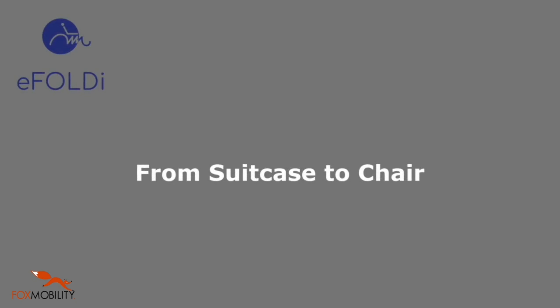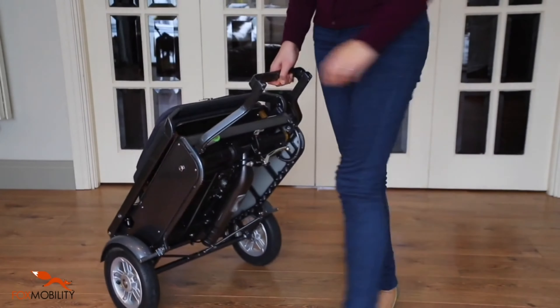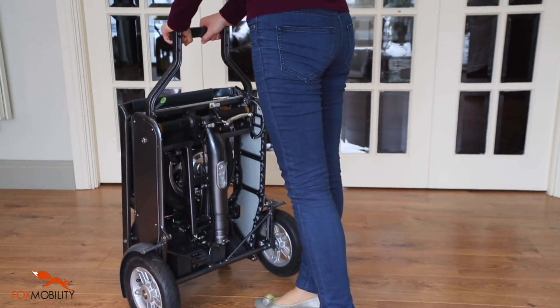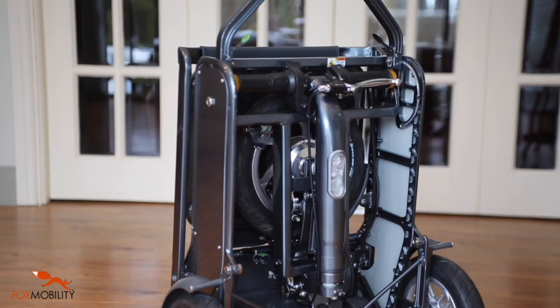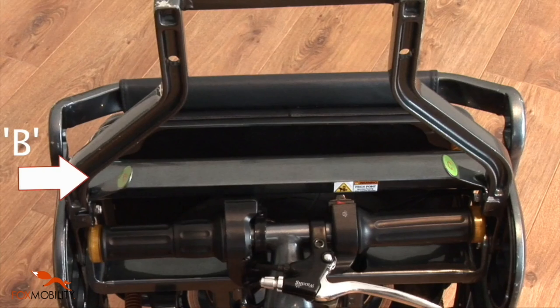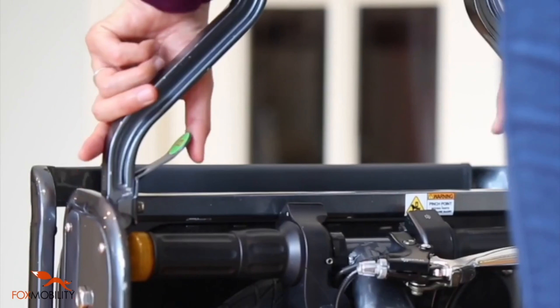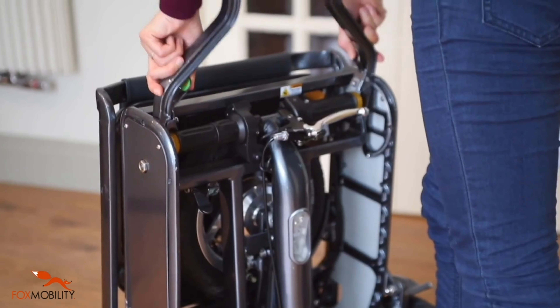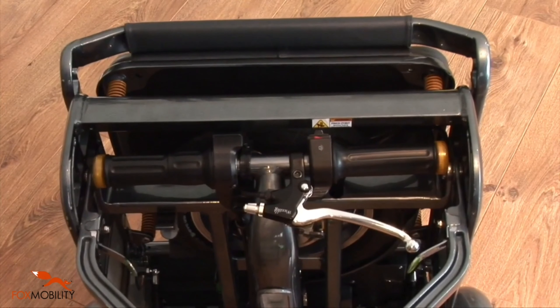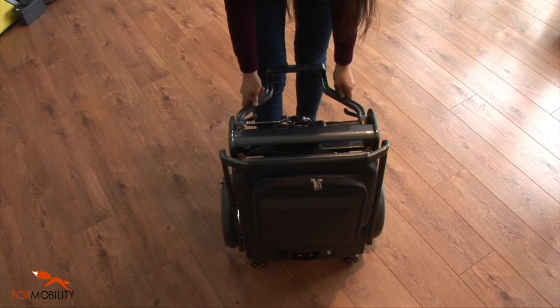Folding the eFoldie from a suitcase to a chair. Position the eFoldie upright with both large rear wheels and both lateral casters on level ground. Grasp the front stand with both hands. Press latch B and C with your thumbs. Push the front stand towards you into its horizontal position. Always verify the pins of latch B and C are securely engaged in the sockets.